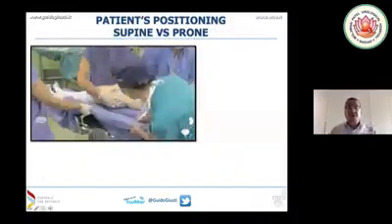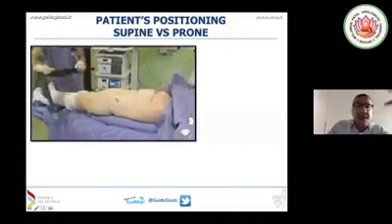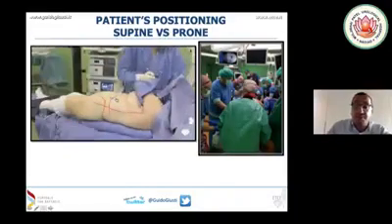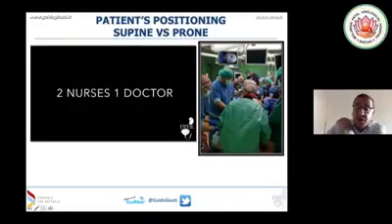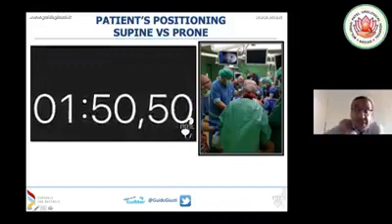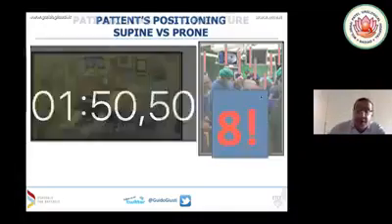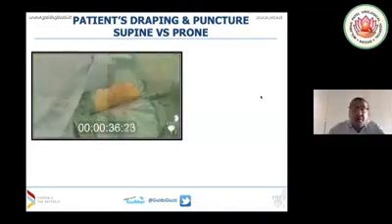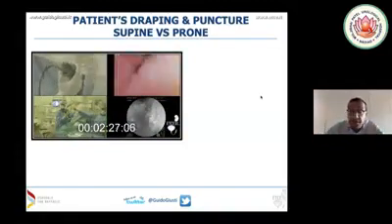So you see that positioning is very fast. After the end of the intubation, placing the patient in position is very, very easy. One doctor, two nurses, and believe me, it is a matter of a few minutes. I don't have a historical picture of my prone era, but this was a picture that I took some years ago in the Netherlands, and look at that, 8 people cooperated to flip this gentleman, not only 3 like I showed you in supine. And also draping of the patient is another advantage because we have a single draping from the beginning till the end of the procedure because we don't have to flip the patient.